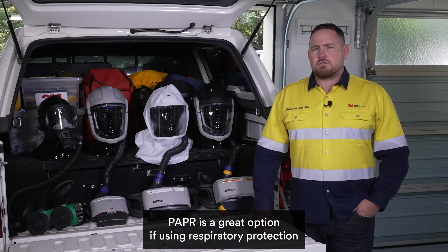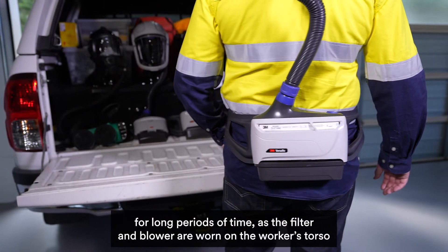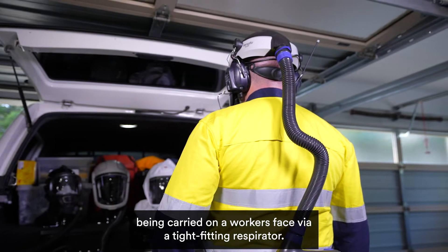PAPR is a great option for using respiratory protection for long periods of time, as the filter and blower are worn on the worker's torso, eliminating the weight of a filter being carried on the worker's face via a tight-fitting respirator.